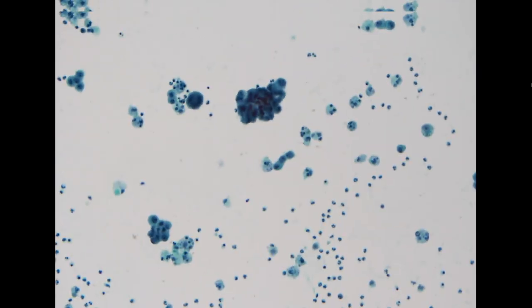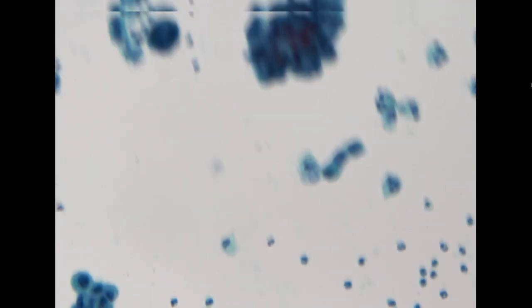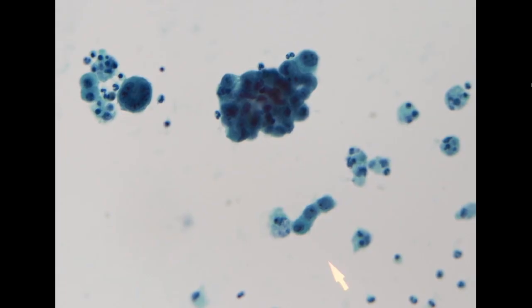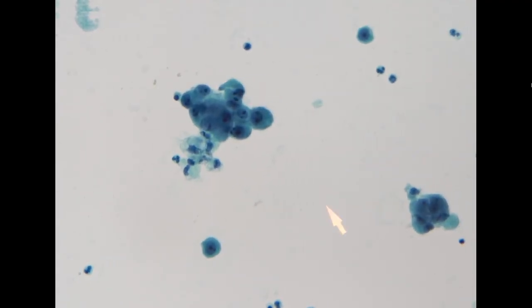But when we go to high power, we really need to pay attention to the cytologic features of these atypical cells and the adjacent normal population, so that we can be confident that these are mesothelial cells. For this cluster of cells, the three-dimensional architecture is not as prominent as what we used to see in metastatic adenocarcinoma.